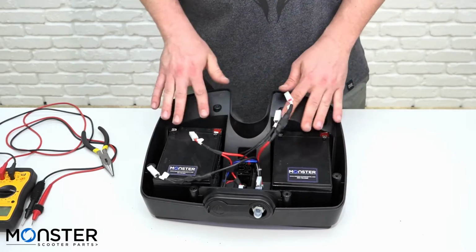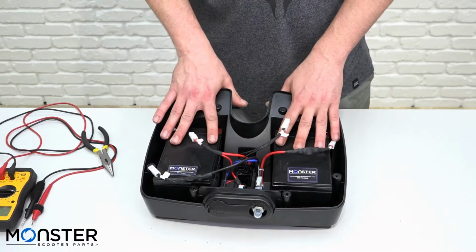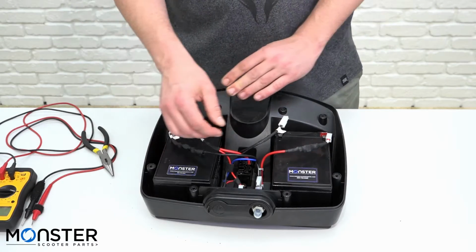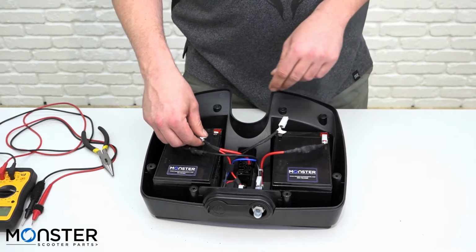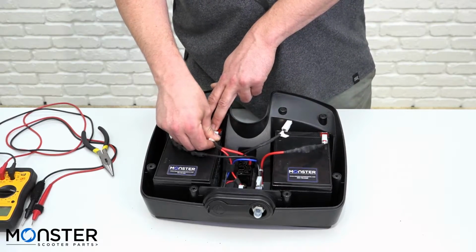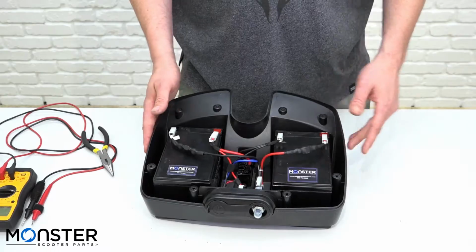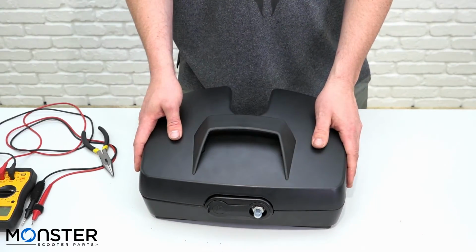Just like that, making sure our terminals are towards the back, with the prongs facing towards the front. We'll start hooking it up with the right outside black wire, then the left outside red, then the right inside red wire, and finishing off with the black inside wire. Just like that, should be good to go. Put your lid back on, and we'll reassemble it.